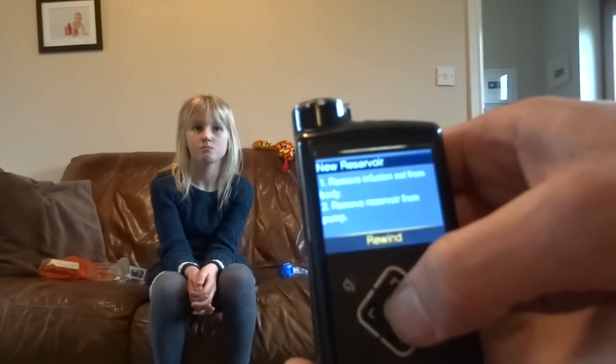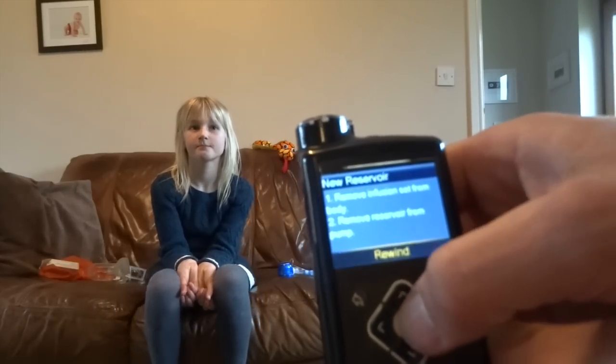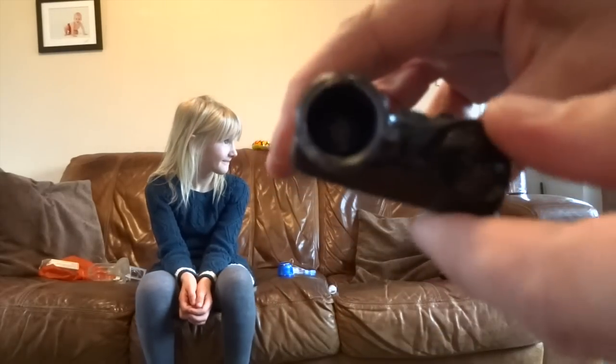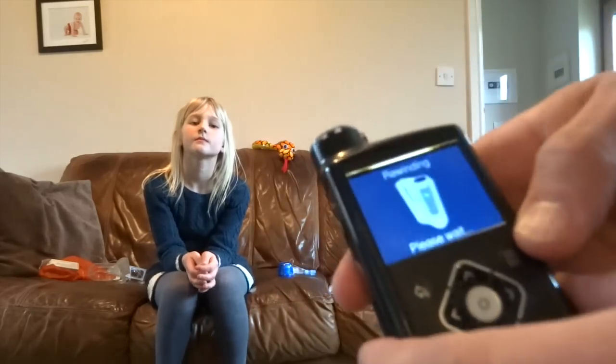New reservoir, which it is. Removing infusion set from body. Removing reservoir from pump. Both done, so we can hit Rewind. And while that's happening, there's a little picture. There's a little plunger in there that's slowly drawing back.